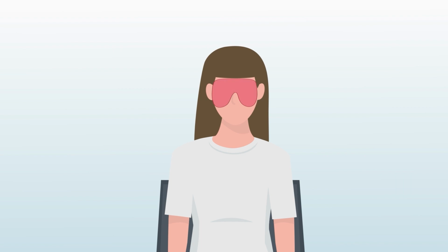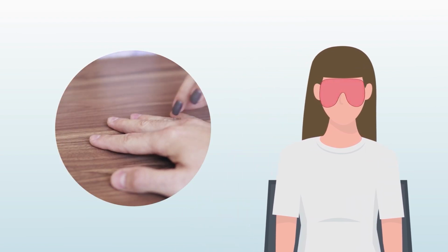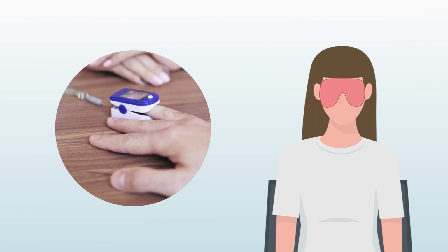Pulse measurements are extracted by tracking the slight color changes of the face caused by pulsation. The method is derived from photoplethysmography, familiar to many through devices such as pulse oximeters. Unlike wearable devices, however, the signal is obtained remotely by analyzing changes in video color channels.